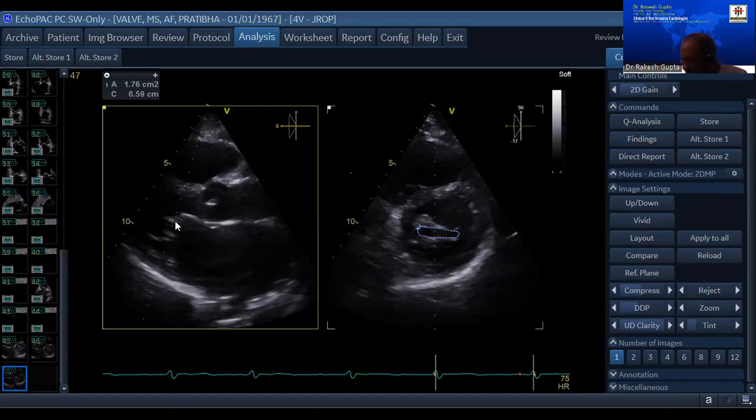Anybody would like to volunteer and tell me what all you see in live demonstration now? Identify yourself and let me know. Hello, sir. Yeah, go ahead.